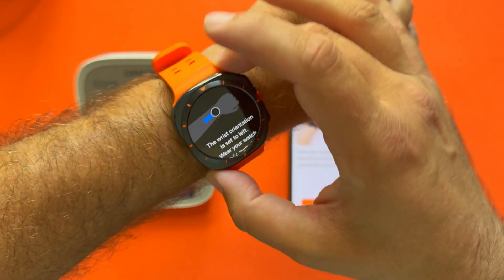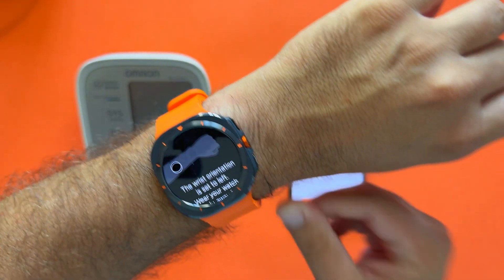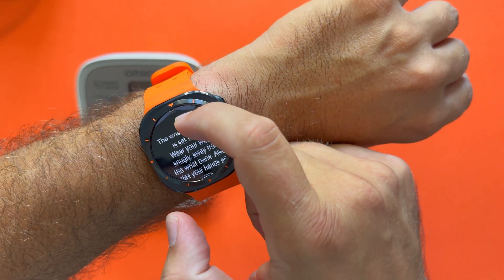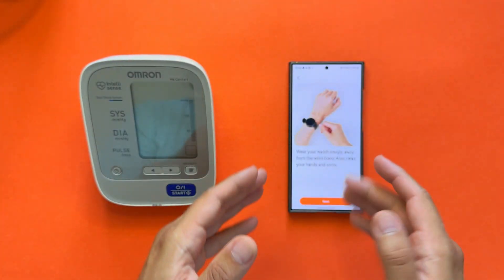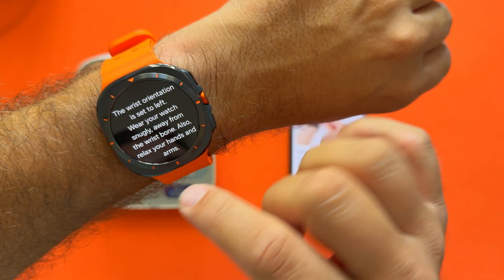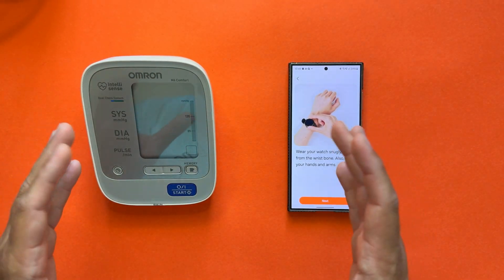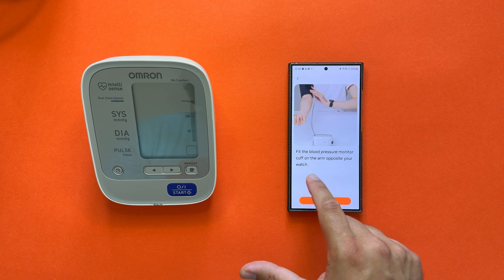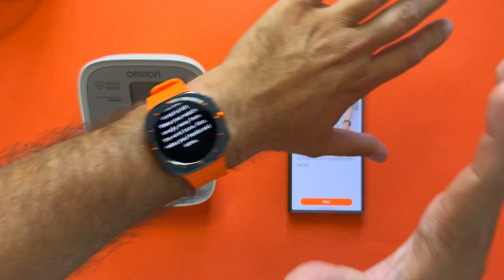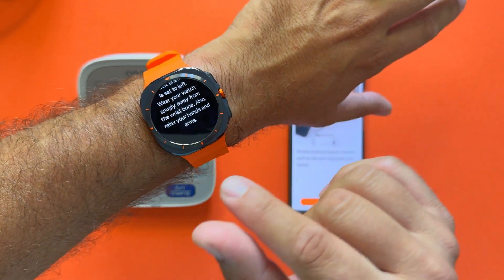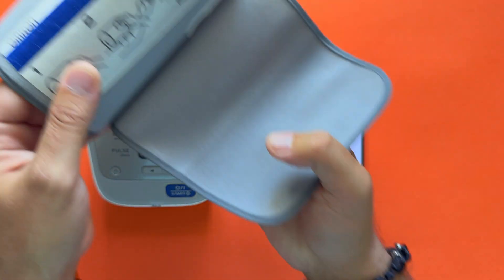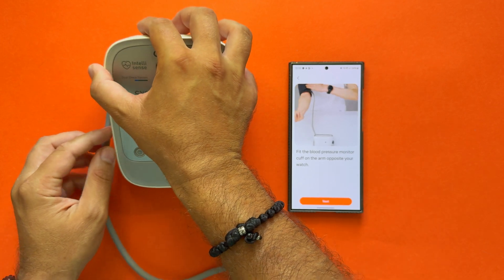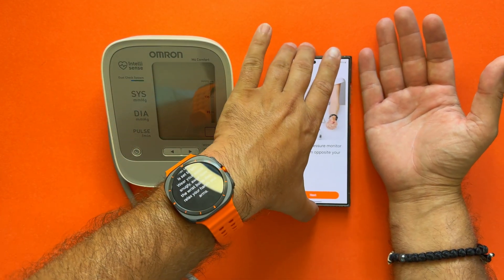I'm going to press Get Started. Wear your watch snugly away from the wrist bone. As you can see, I have it there, it's away from my wrist bone, it's very snug. The wrist orientation is set to left, wear your watch snugly away from the wrist bone. Relax your hands and arms. Now again, I need to warn you, I'm not in the best comfortable position here on my review table. Fit the blood pressure monitor cuff on the arm opposite from your watch. This is very important—I'm wearing the Galaxy Watch Ultra on my left hand, which means I need to attach the cuff on my right hand. Let me attach it. All right, the cuff has been attached.